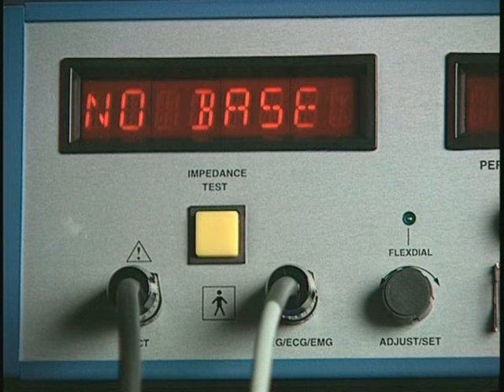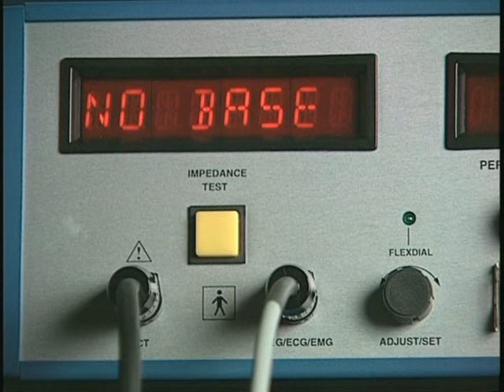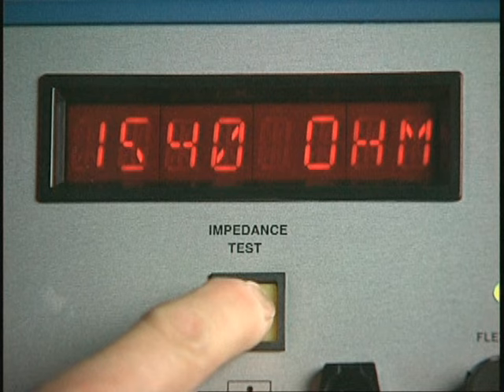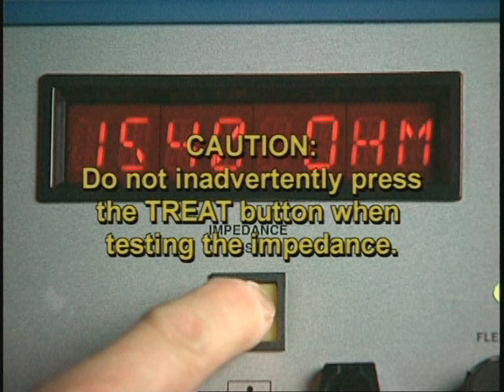After the recording electrodes are applied to the patient as described in the user's manual and the electrode lead wires are plugged into the recording cable and clipped to their corresponding electrodes, press the impedance test button to test patient static impedance and verify the quality of connection to the patient. Caution: do not inadvertently press the treat button when testing impedance.